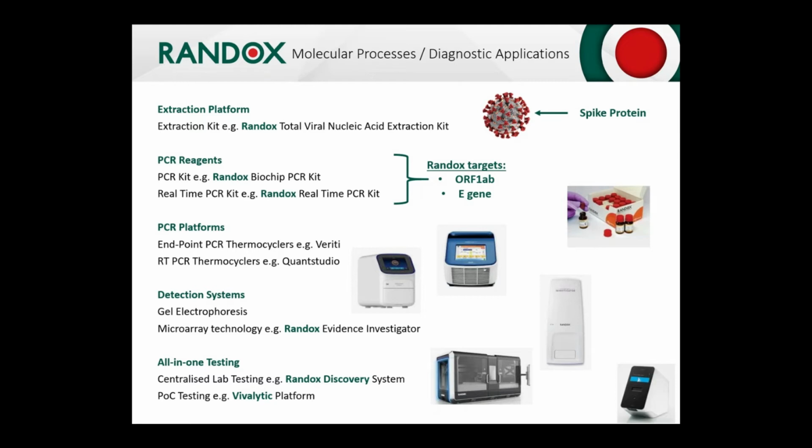An example of that you should see on the screen at the bottom of the page is the Randox Discovery system, which can analyze many different samples at the same time within one machine. So you've got your extraction in one particular part of the machine, and then in the middle part of the machine you've got your amplification part, and then on the other side of the machine you've got your detection part of the molecular process. The results can vary on the type of assay you're using, but you can typically get a batch of 16 results within a couple of hours, and then for every hour after that you'll receive another batch of 16 results.